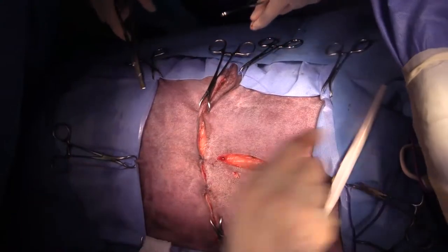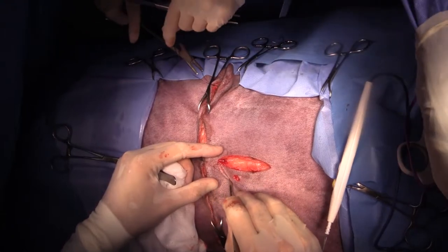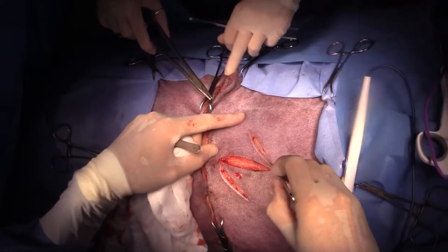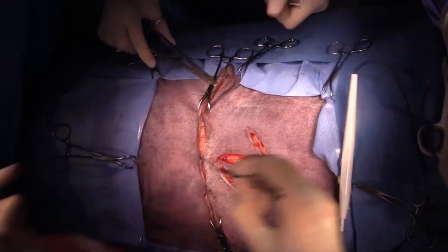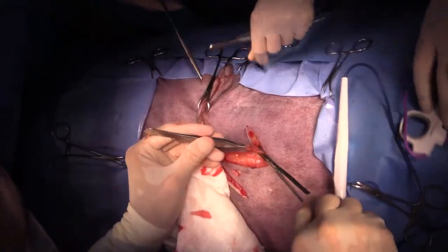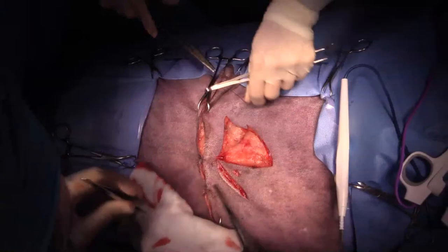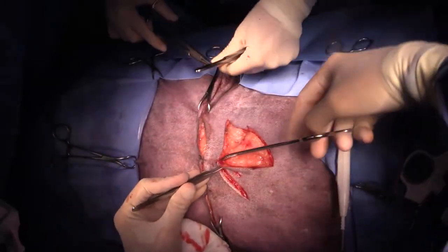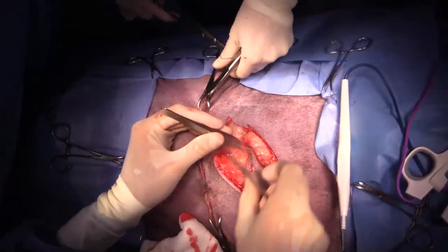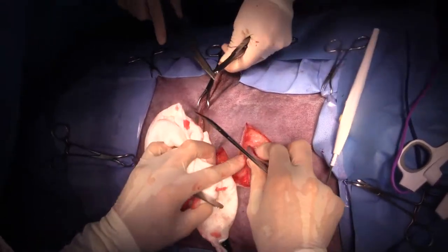All right, so our horizontal portion goes parallel to lines of tension, usually perpendicular to the incision. And then we make two more incisions like this, so it looks like a Z. Or a Z in America. Okay. And then we completely release both limbs like this, and then we pull them down opposite like that. So really relieve a lot of tension there.